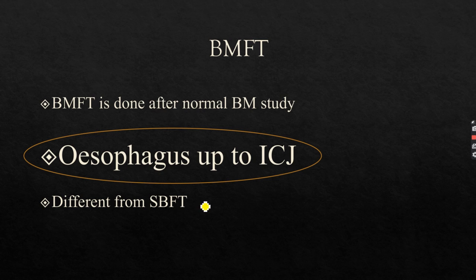It is different from SBFT, small bowel follow through. Remember this. BMFT is different and small bowel follow through is different. BMFT also includes the esophagus, the stomach, the duodenum, then jejunum and ileum up to the ileocecal junction. Whereas in SBFT, we are directly injecting barium into the small bowel. Esophagus is not covered, stomach is not covered, right? In SBFT.